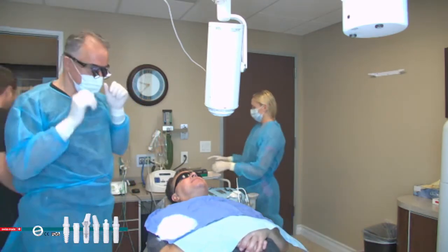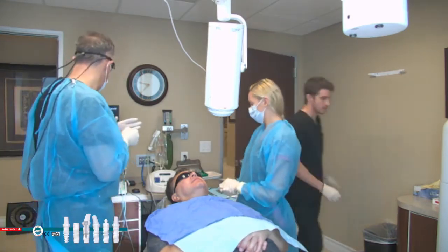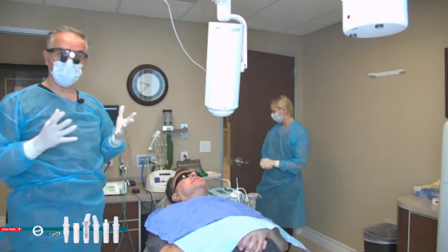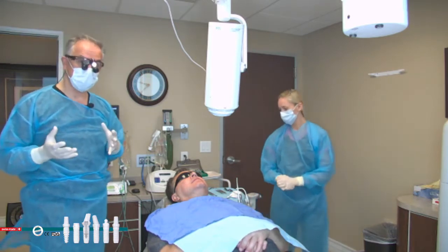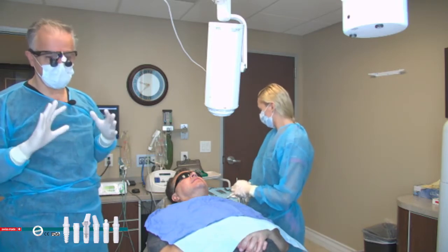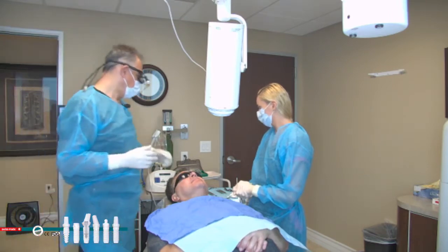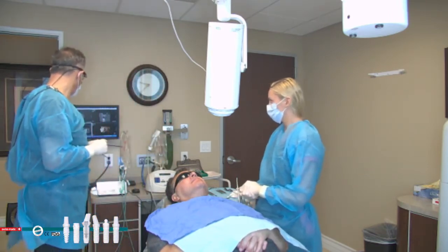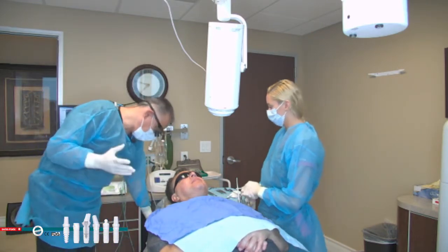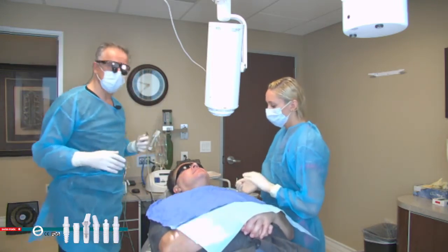So he had 3 titanium implants on the upper left side, and 2 on the upper right side, and 2 in the lower. The 3 on the upper left were replaced with zirconia implants last year. The ones on the upper right, there is 1 left, which is doing okay. We're going to leave it alone, and we're just adding a zirconia implant in there today. And the one on the bottom left is doing okay, so we're going to leave that alone as well. But my guess is that the titanium implants usually break down 5 to 7 years after placement.